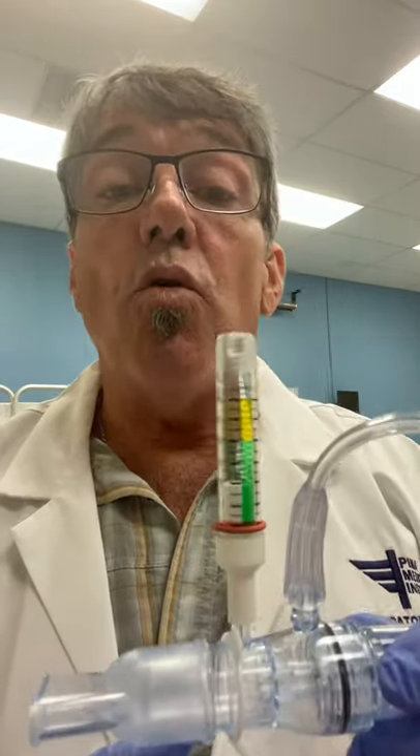As with all of our procedures, we would follow our performance checklist. We would go ahead and check the patient's chart, check the orders, review the chart for any important information. Once we get to the room, we want to introduce ourselves to the patient and which department we come from. We obviously want to have all the equipment ready, and then we want to observe proper hand hygiene and any PPE depending on any isolation precautions. Most people would recommend nowadays using gloves all the time for all patients.